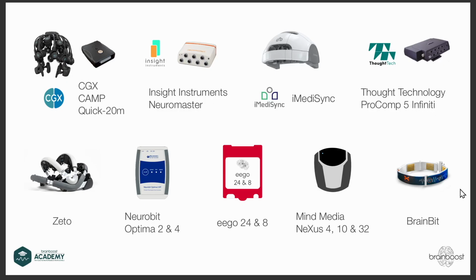As always, we connect our hardware to our software, to many different hardwares. We keep on working, connecting more hardware. And also if you have different hardware manufacturers, you can always tell them, hey, why don't you work with BrainAssistant? And then we forward them to us.